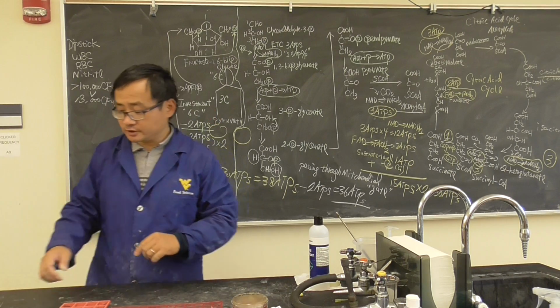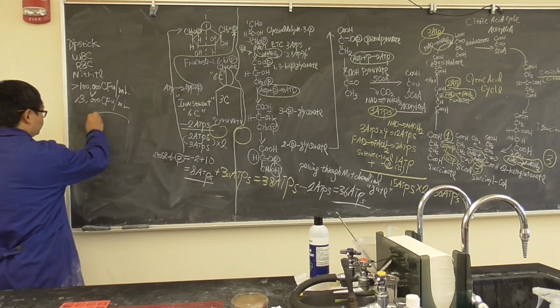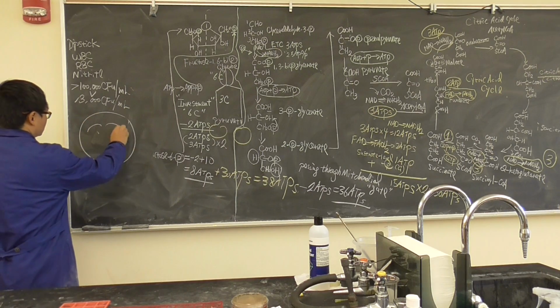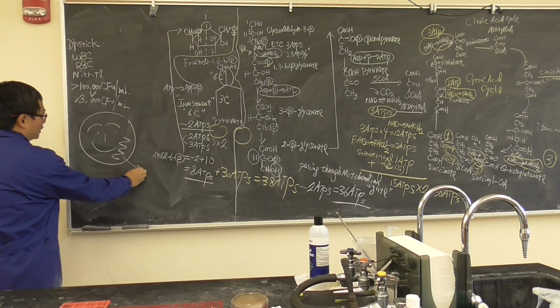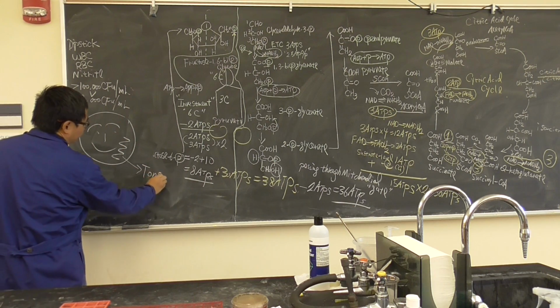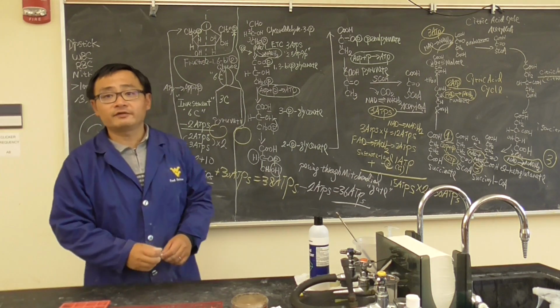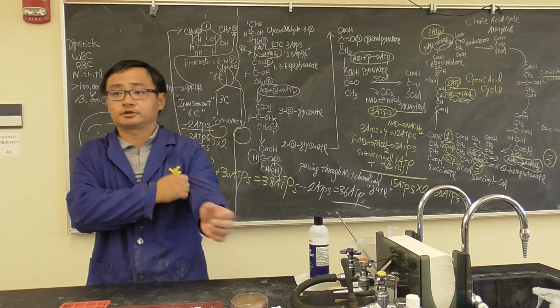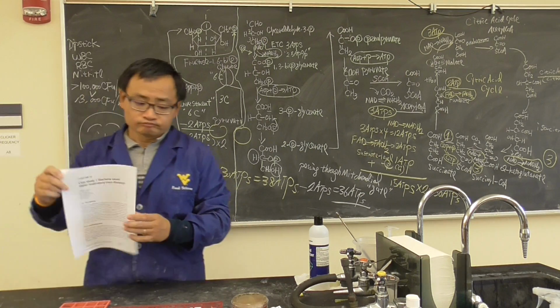So today we'll have another clinical trial. Okay, how are we gonna do it? Do you have tonsil? You have tonsil, is that right? Majority of you. If you don't have it, you can just share with your bench partner. What we will do is a clinical trial.